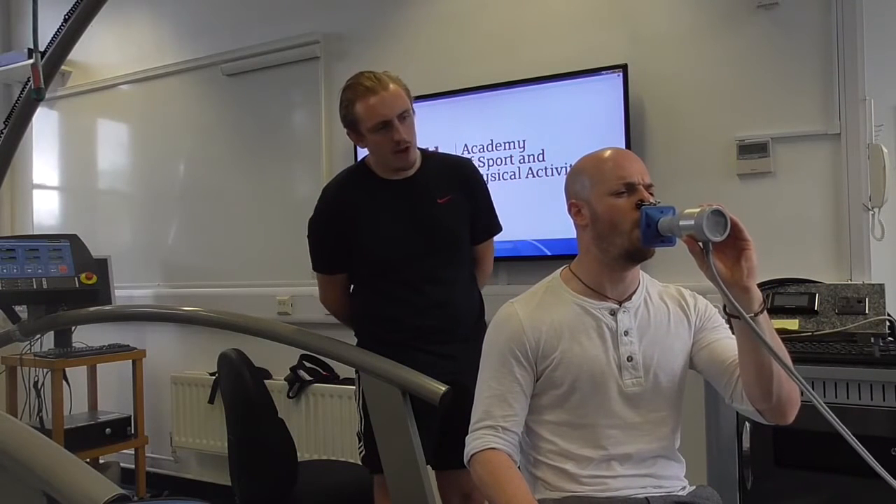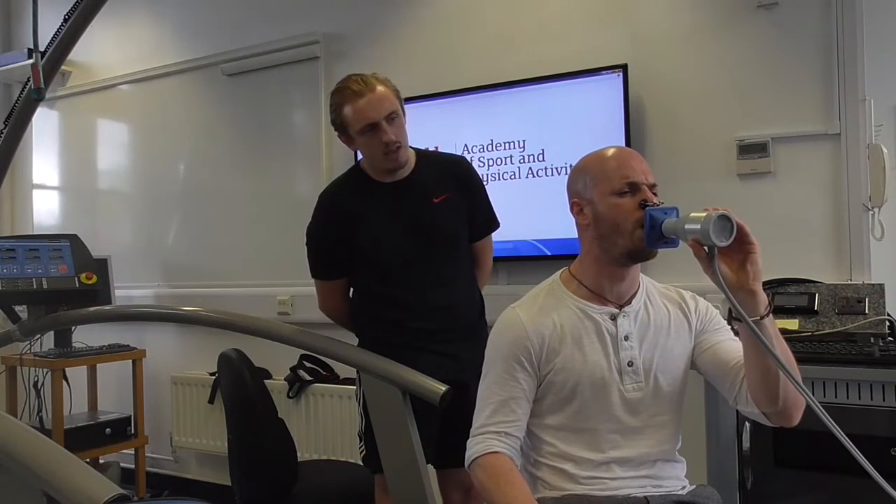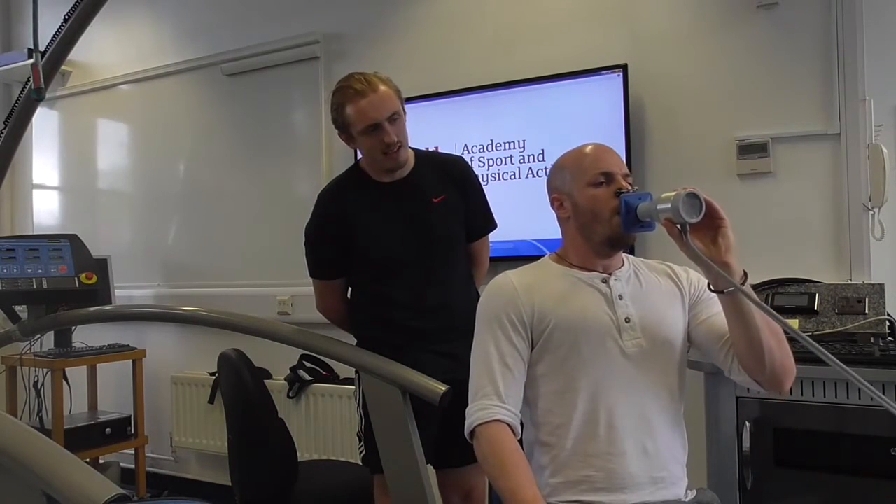Keep going, keep pushing — empty the lungs completely. Keep pushing, keep going — and relax.